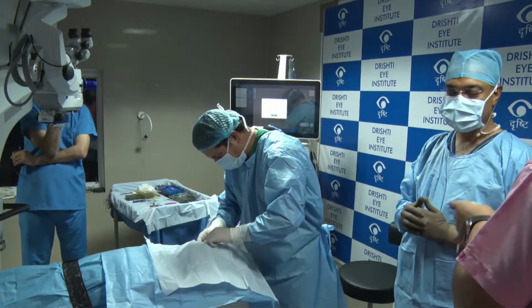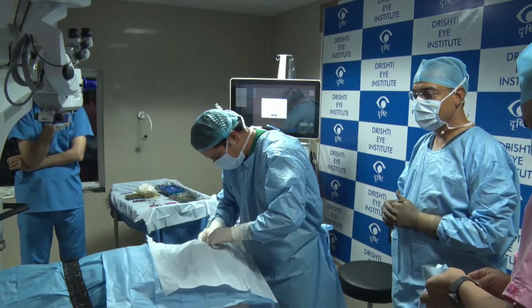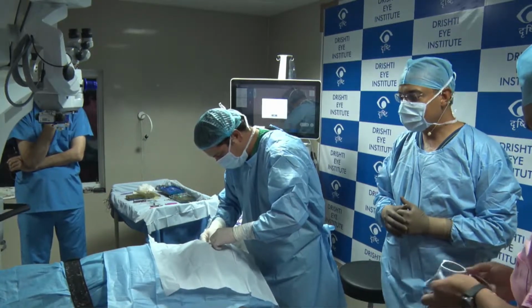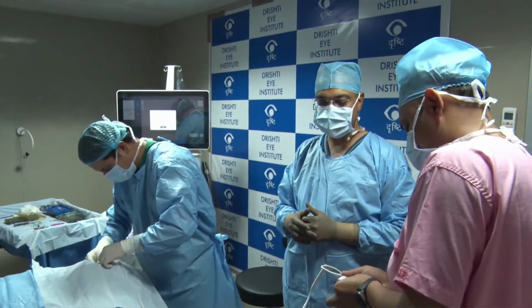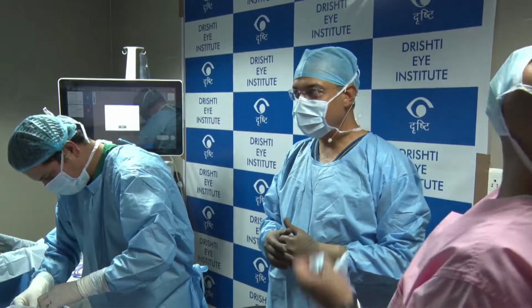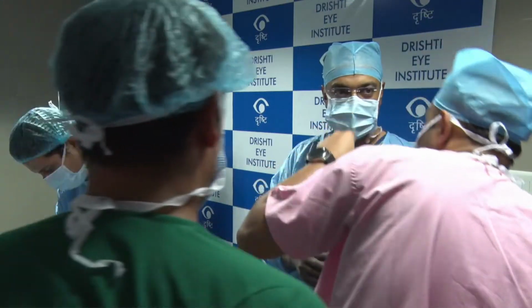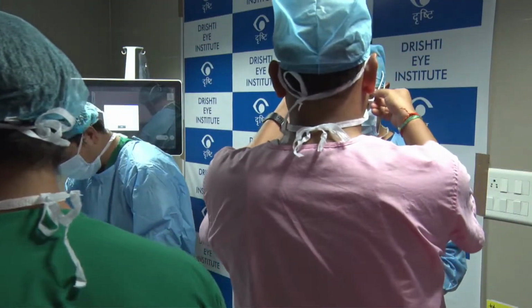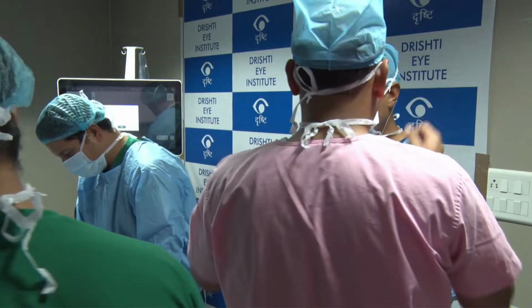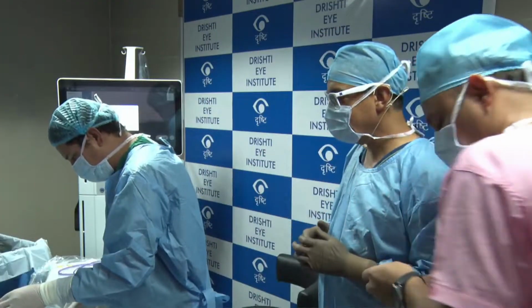Can you hear me from the hall? Dr. Gaurav, can you hear me? Yeah, can you hear me? Yeah. So we were cleaning and draping this patient because this is also for 3D. Yeah, I can see that, but we are not getting the 3D transmission. Okay, we are just going to switch it on. We'll take a moment. Okay. We can see you and we saw the cleaning and draping. We'll be with you in a moment.